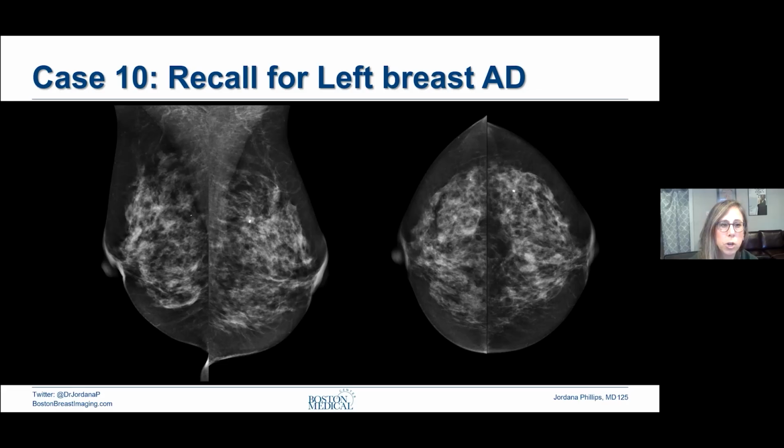So this was a patient who had architectural distortion in the left breast, marked by that yellow arrow. And we did a biopsy, a tomosynthesis guided biopsy, and you'll see that our clip is actually not where the architectural distortion was. So we weren't sure what to do about this. Did we sample appropriately the distortion and the clip moved, or were we just off? And this can happen with tomosynthesis guided biopsy. I imagine everybody on the call, or at least many people on the call, have had this issue.